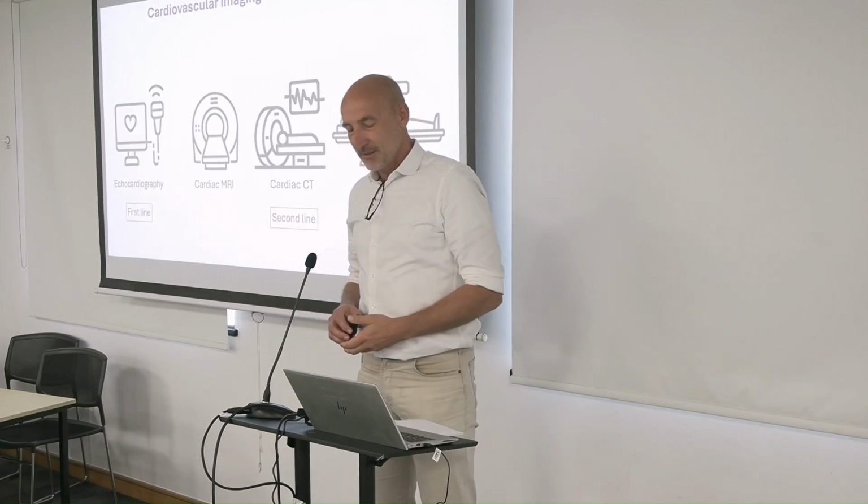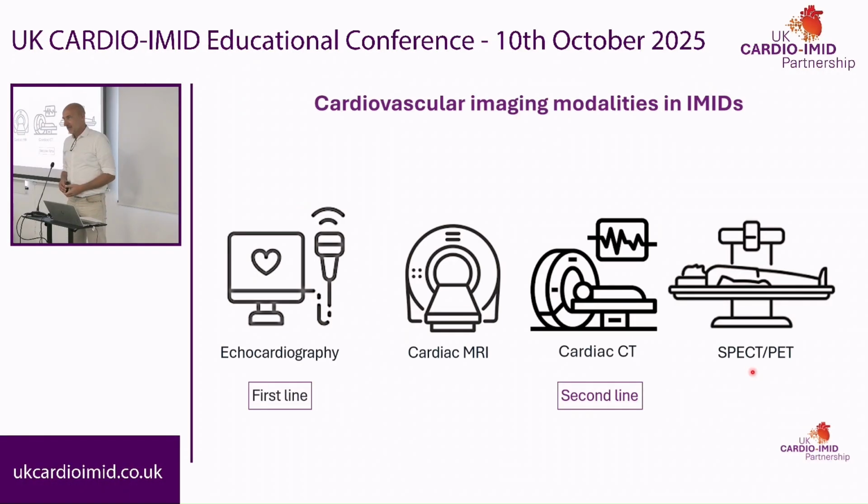Cardiac CT is really important in everything to do with the coronary arteries, whether it's, as we heard, coronary stenosis, whether it's fat or inflammation, perivascular inflammation, etc. And then cardiac MRI is the topic of this talk. So cardiac MRI in general is quite good at things that are relatively big. So MRI is good at looking at the myocardium and things that don't move very fast.